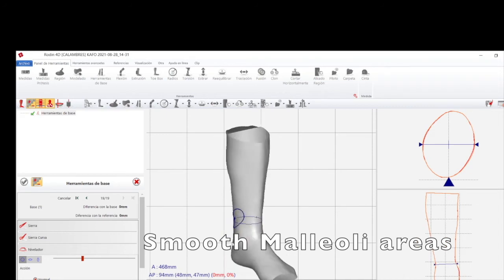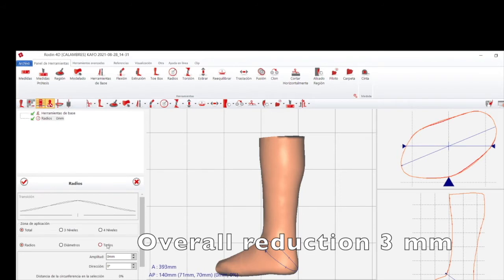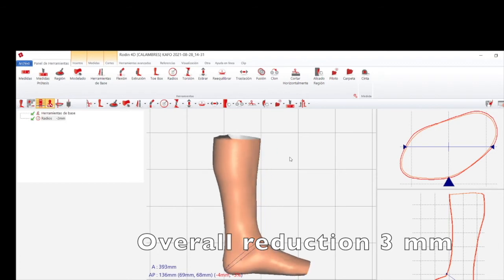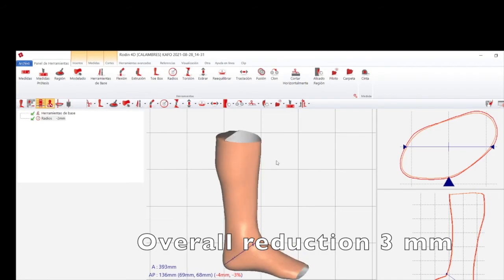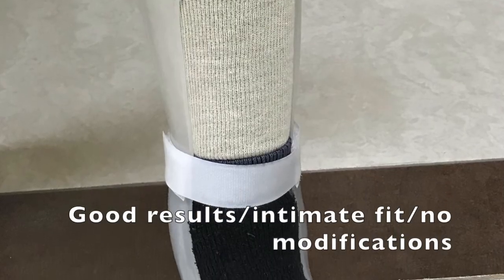Then we are going to reduce the thickness of the tube or C-Form by using another tool to do a global reduction — about two to three millimeters to account for the thickness of the bandage. That's all you need to do, and then your model is ready to fabricate the AFO. This is how long it takes.